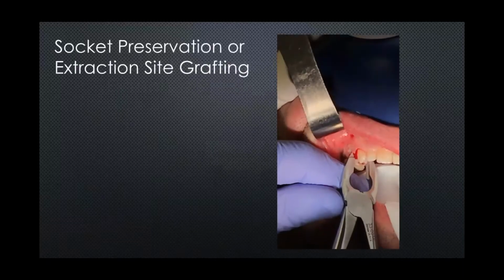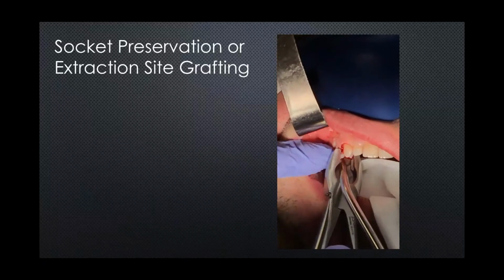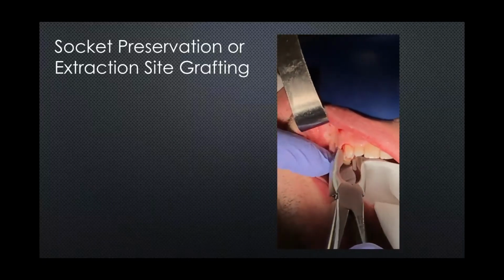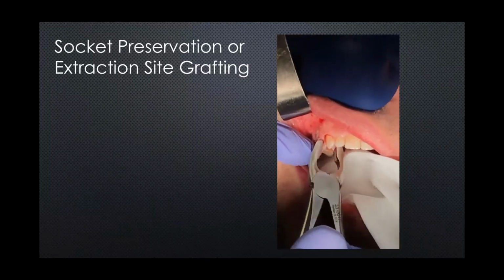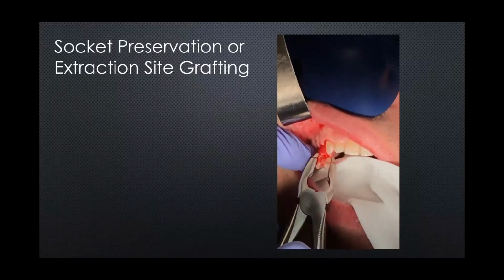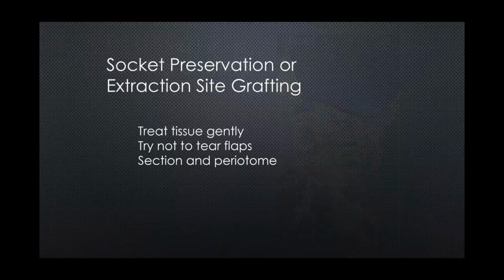Okay, once again, we talked about this before, seating your tissue, your beaks below your tissues on the lingual, the palatal, and the buccal, making sure you support the alveolus. And it's an apical pressure here, and then gently traction and rotation. We take the tooth out. Okay, atraumatic extraction techniques. Nice and easy, less chance of swelling, less chance of discomfort for our patients. Okay, we talked about that.